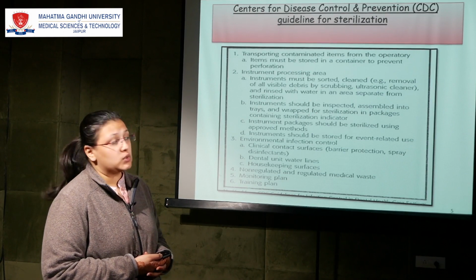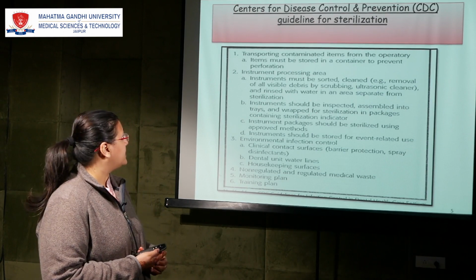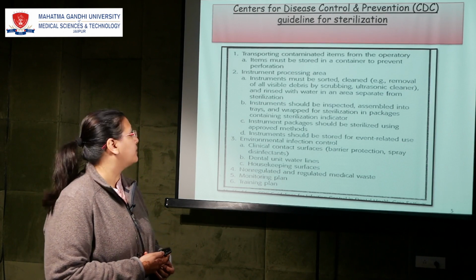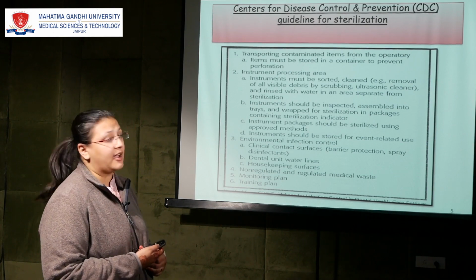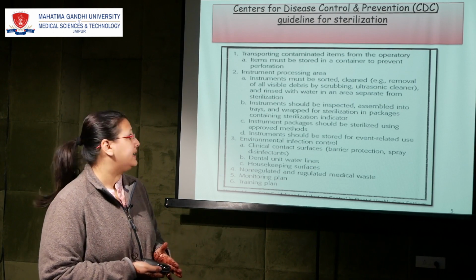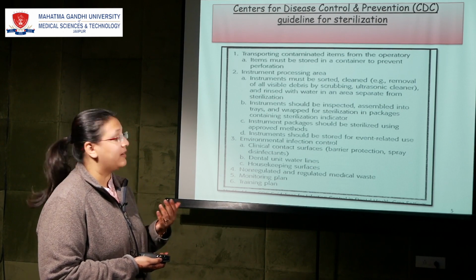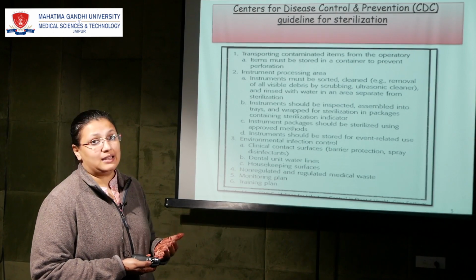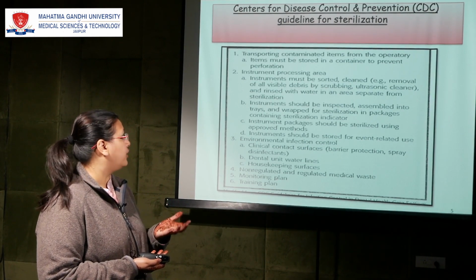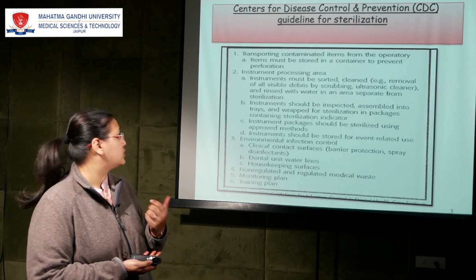According to guidelines given by the CDC, first we transport the contaminated items from the operatory. Then we should have an instrument processing area where instruments are sorted, cleaned, scrubbed and rinsed with water. Then they should be packed, sterilized and then stored.